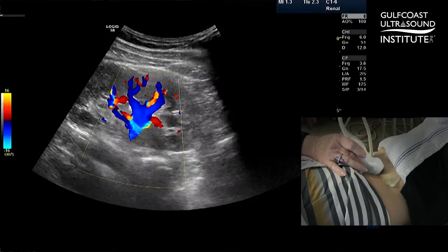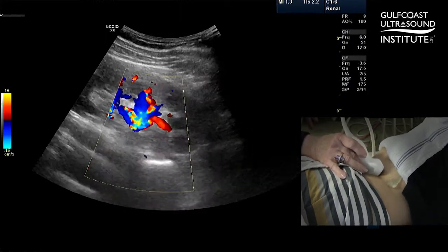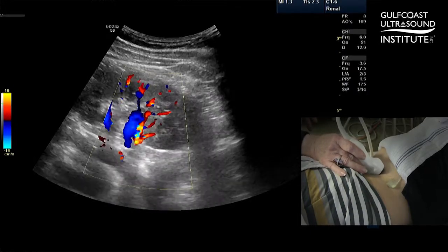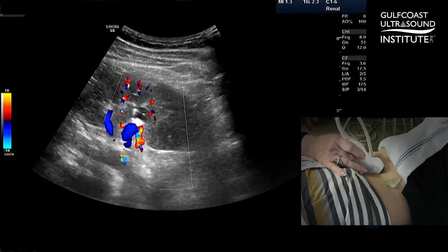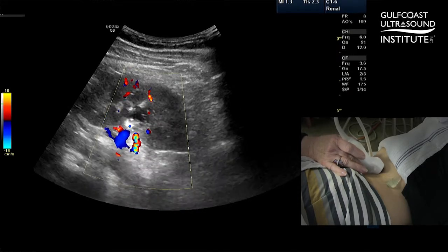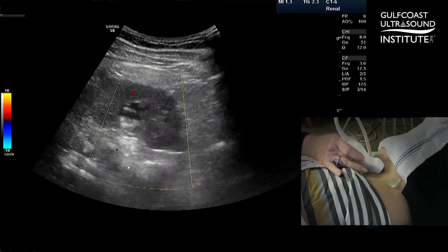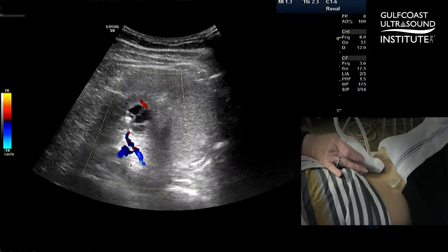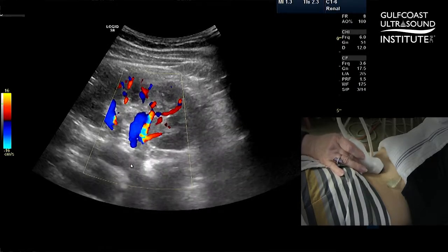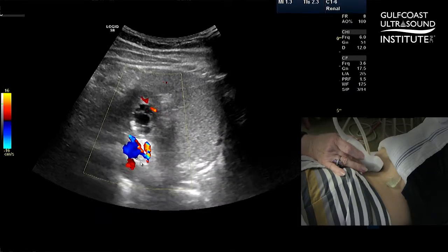I'm going to ask the model to take in a deep breath, and we're going to bring that renal artery down to the aorta. Here we can see the renal artery and the vein. If you think in terms of a clock, with 12 o'clock at the top of the screen and 6 o'clock at the bottom, I'm literally opening the pelvis of the kidney at about 6 o'clock. The renal artery, as you see here, should come straight down and connect with the aorta.